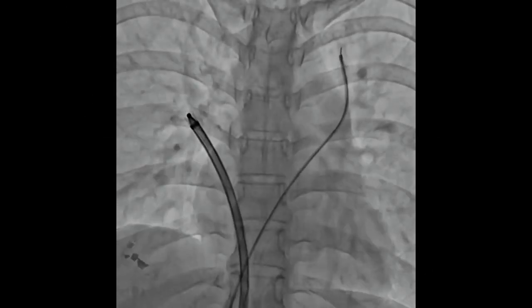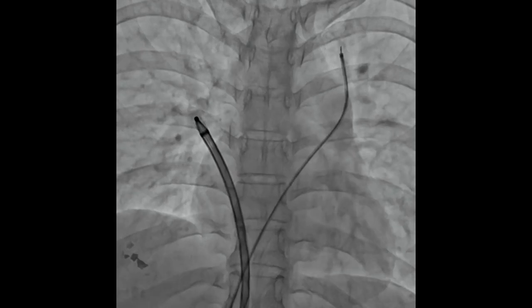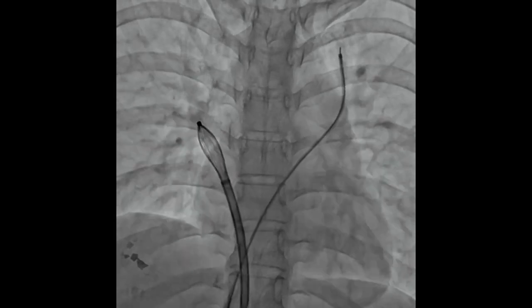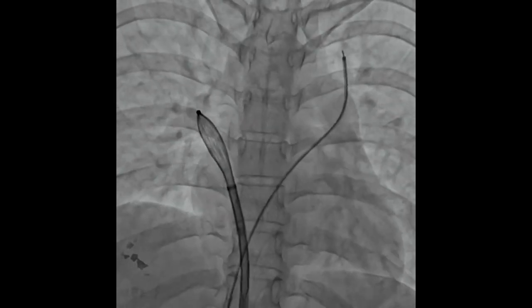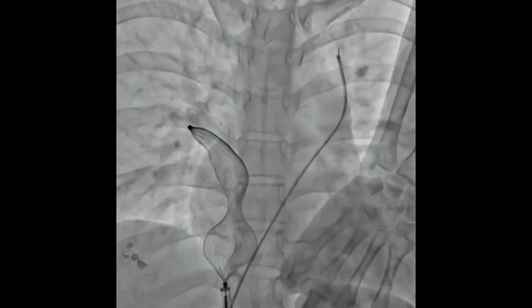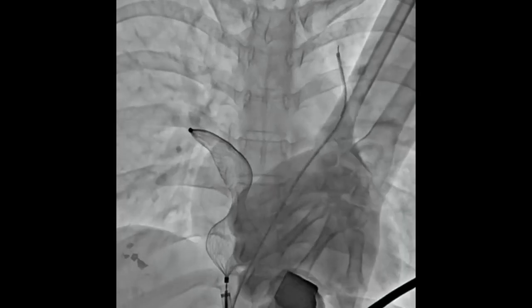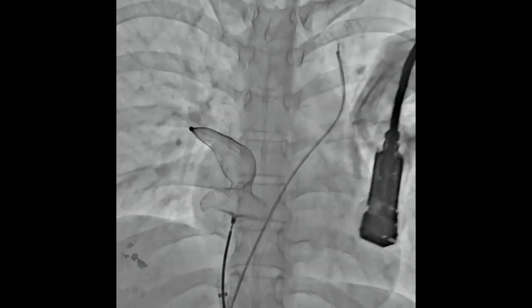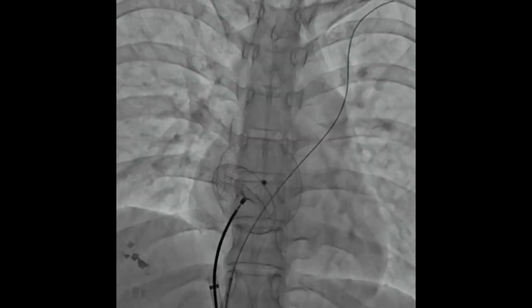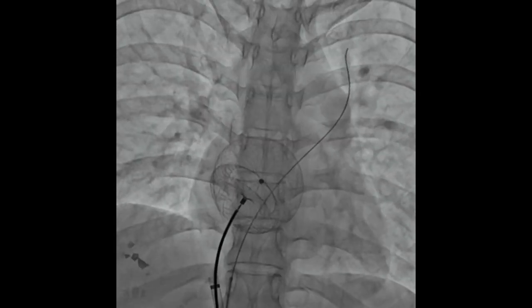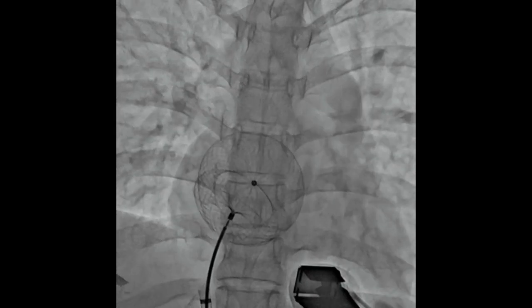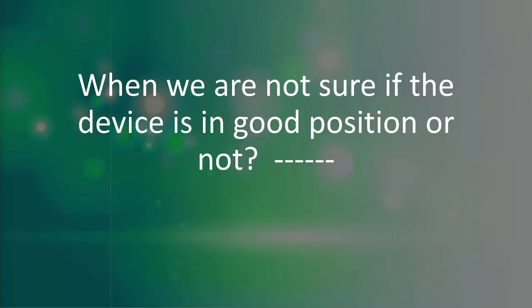We took the catheter on the other venous puncture. From the RUPV approach, we are engaging the device and keeping the wire and catheter in position, and then we gradually pull the catheter and the wire. So this is one technique.